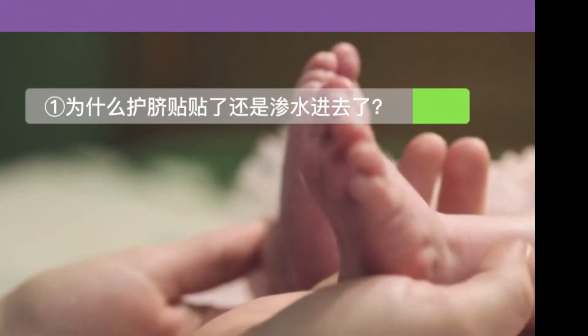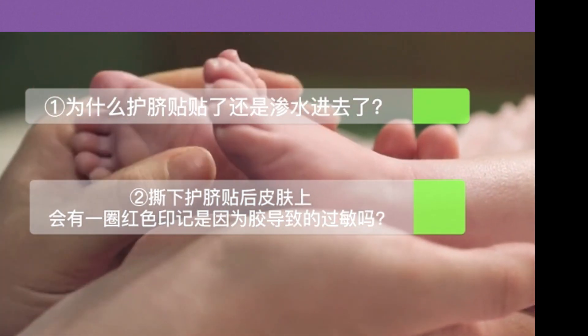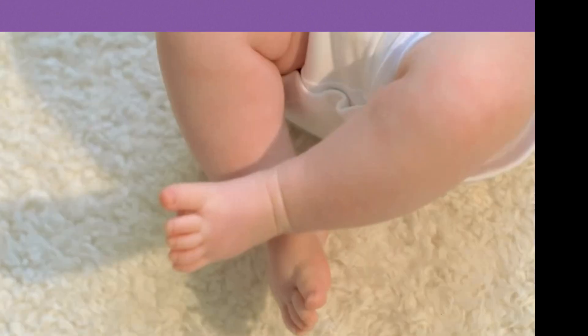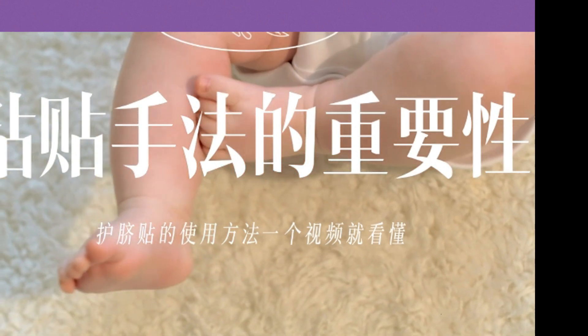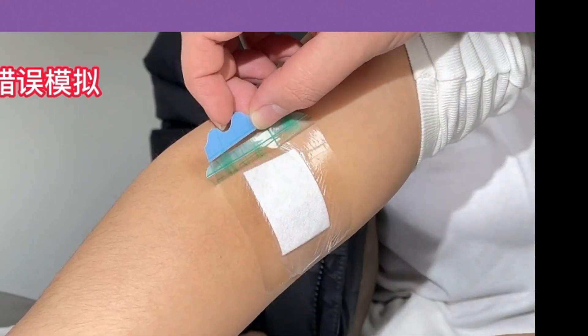Some parents have reported: why does the umbilical patch still seep water after being applied? After peeling off the umbilical tape, there will be a red mark on the baby's skin — is it an allergy caused by the glue? What should I do if my baby feels pain when it is removed? In fact, all three of these issues are caused by problems with the pasting technique.